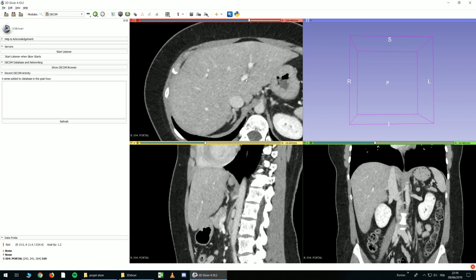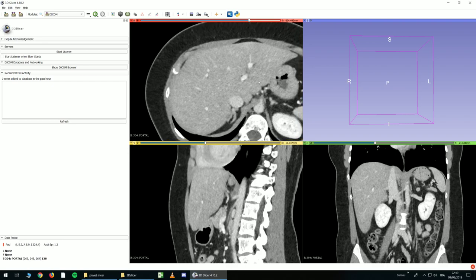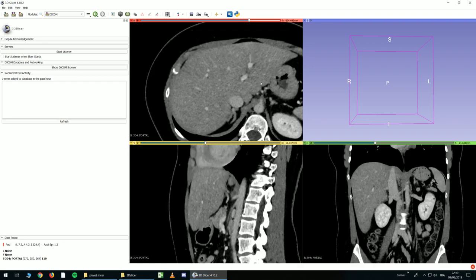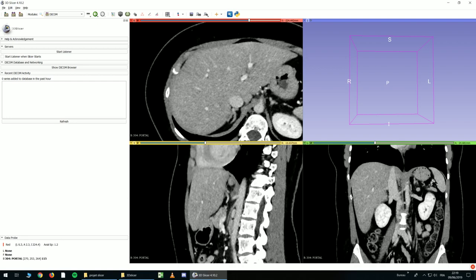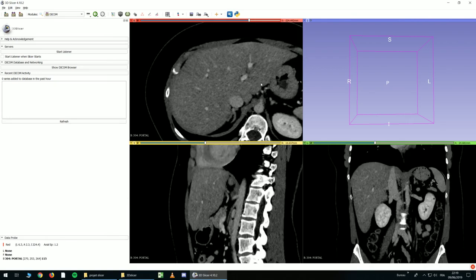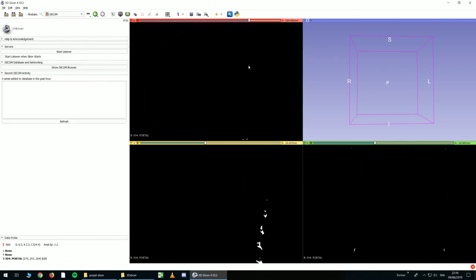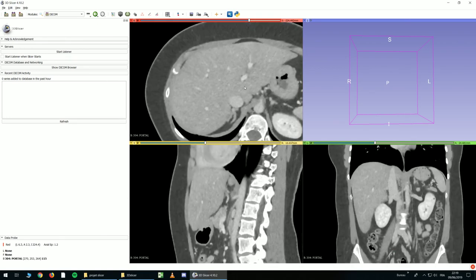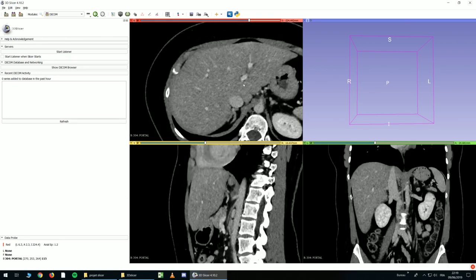And to change the contrast, you just have to left-click and move the mouse, and you can choose and do whatever you want.